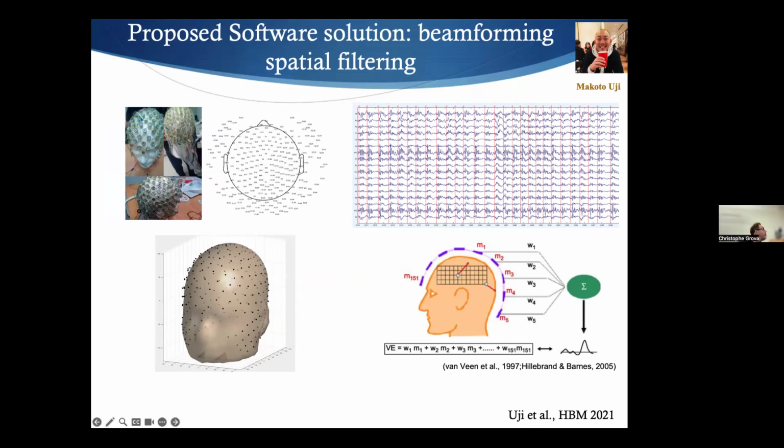I will not talk much about that, but it's something very interesting that we did manually. It's Zhengshen who did that first. As you can see here, there is a loop, and actually we have 4 or 5 of those. This is what we call a carbon wire loop. This is another technique that we use to measure artifact only. So if you put a loop in the scanner, it is a conductive loop.